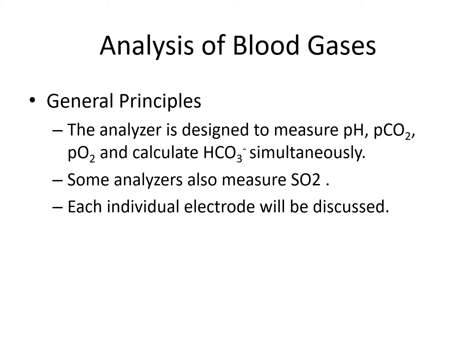The anticoagulant that should be used is heparin, and we must prevent the presence of bubbles whenever we do blood collection for blood gas analysis, and we should seal the needle immediately with cork or the stopper to prevent leakage of gases.